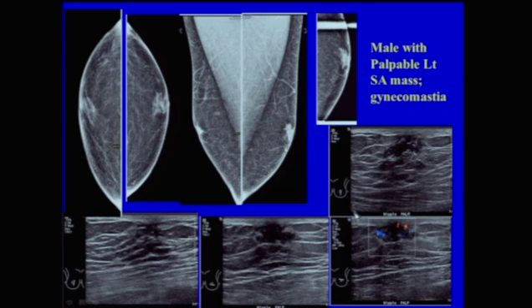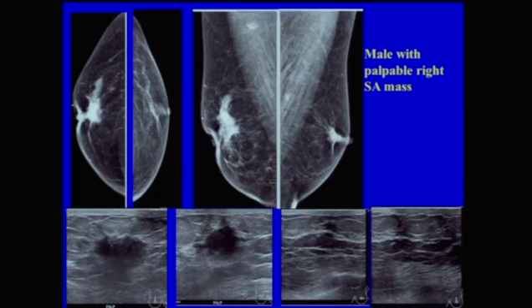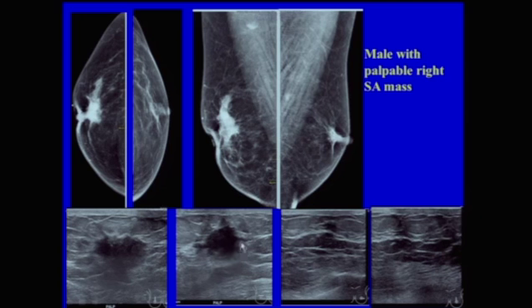The male breast is included in this section. A male patient with a palpable left subareolar mass shows asymmetry between one side and the other on mammogram. Posterior to it there was irregularity and increased flow — this patient had gynecomastia. Sometimes in these cases biopsy is necessary if the diagnosis can't be made with ultrasound and mammogram alone. Another male patient with a palpable right subareolar mass showed irregular borders and nipple retraction on mammogram, and an irregular hypoechoic mass on ultrasound — this was an infiltrating ductal carcinoma.